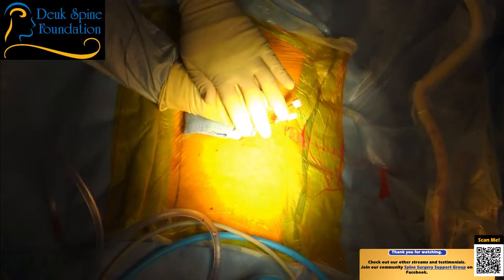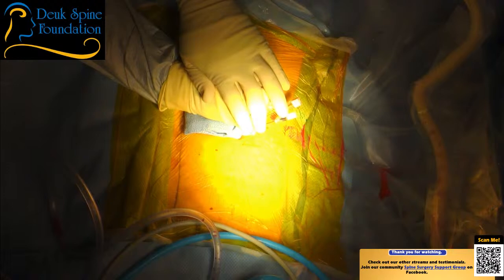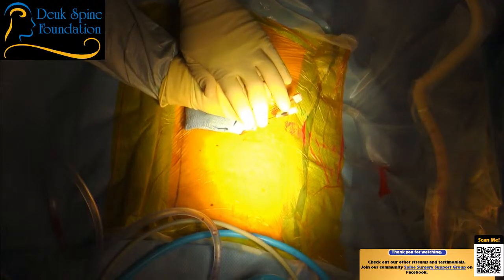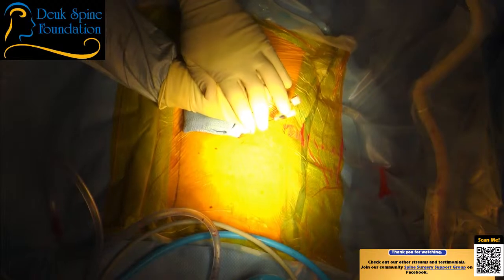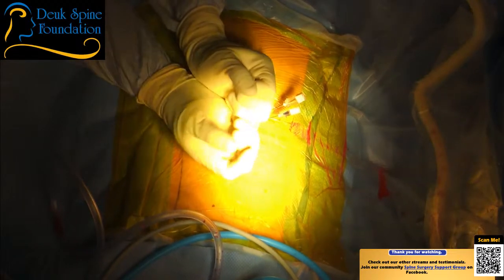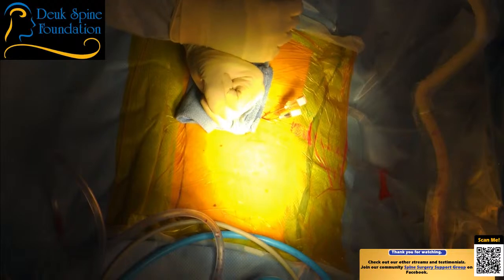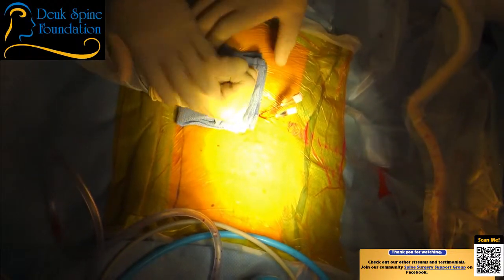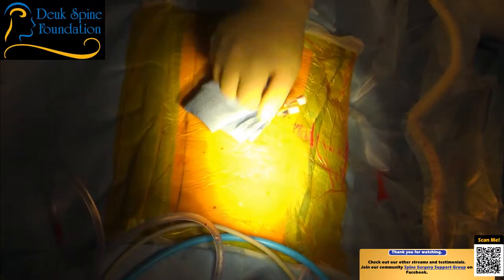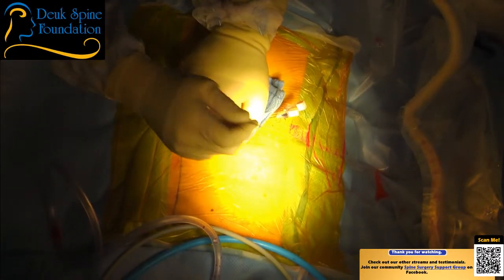So removing bone spurs doesn't fix the patient. Removing the source of inflammation does. And the source of inflammation is the annular tear that I just got through debriding. The annular tear. So bone spurs rarely ever need to be treated. They need to be treated when they're causing severe compression of nerve roots and spinal cord.